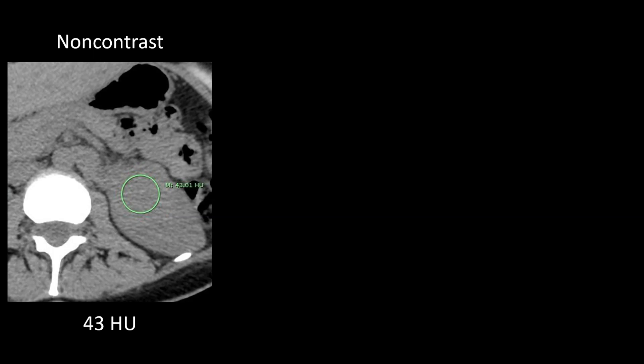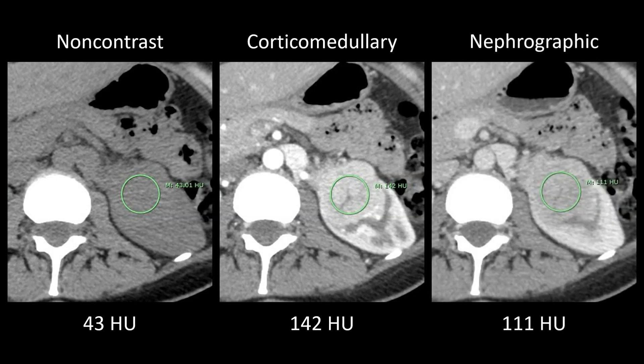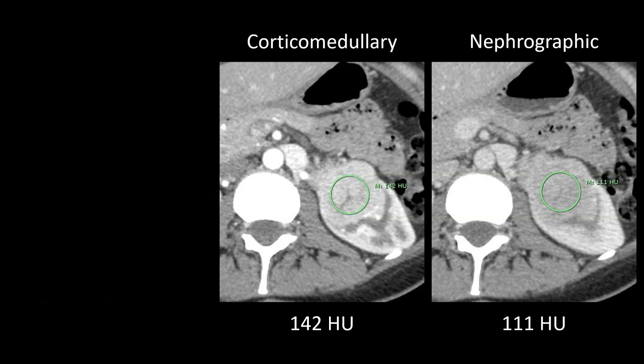Looking at the non-contrast series, the density of the mass is 43 Hounsfield units. Fluid or cysts tend to have a density of 20 or less, so anything above 20 raises concern for either a hyperattenuating cyst or a renal tumor. After intravenous contrast in the corticomedullary phase, the mass increases to 142 Hounsfield units — an increase of nearly 100 — which indicates definite enhancement. True enhancement requires a density difference of 20 or more. On the nephrographic phase, density drops to 111 Hounsfield units, still well above baseline — confirming definite enhancement.